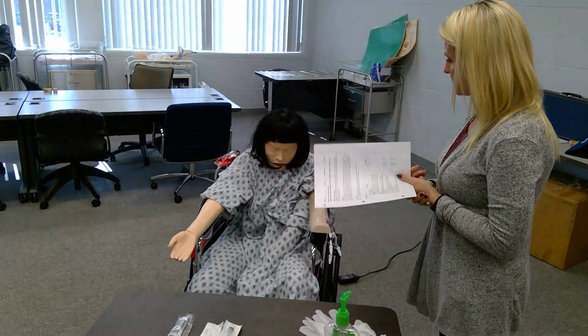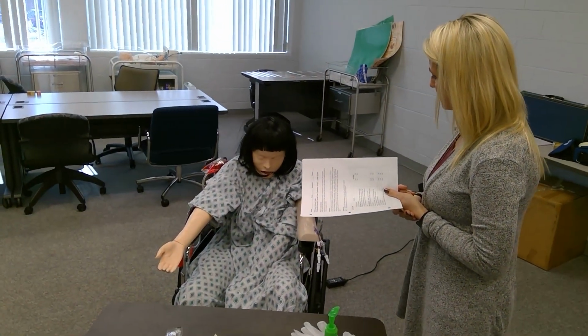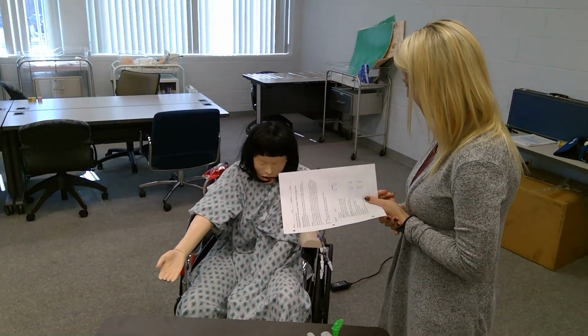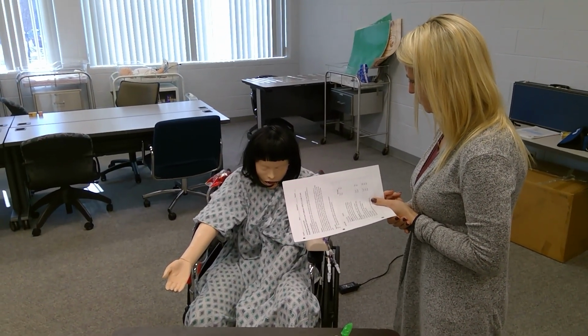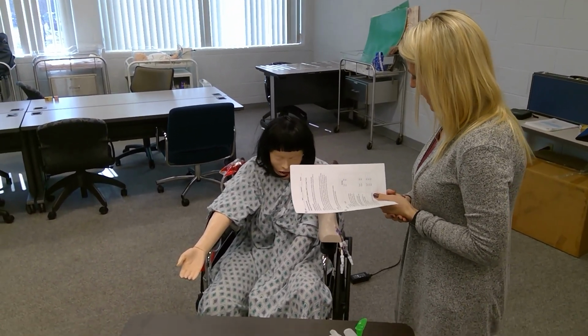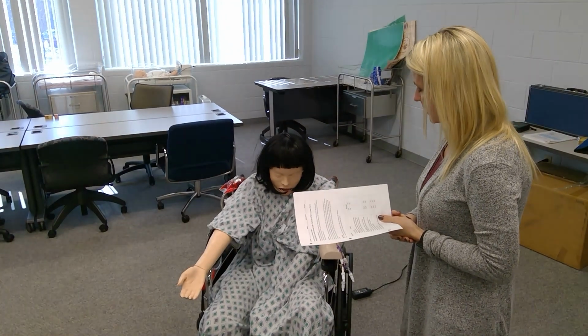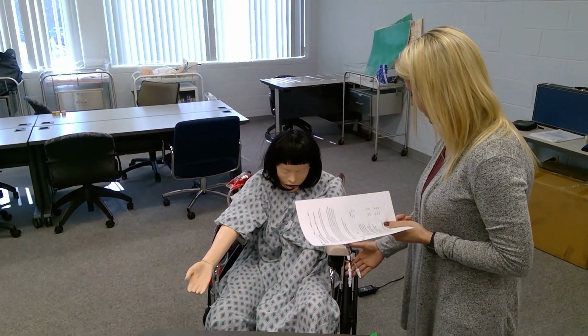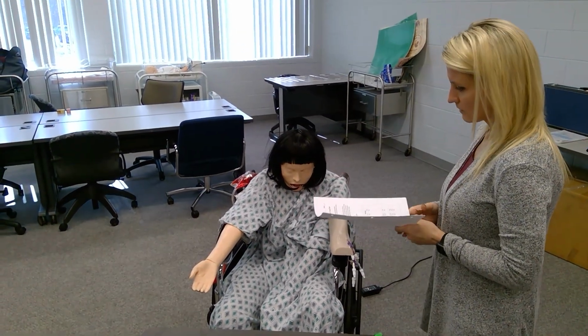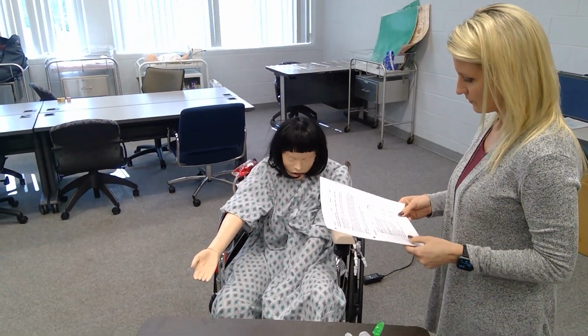Hi Sarah, my name's Brooke and I'm your nurse. Hi, how are you feeling today? Well, good. Hopefully we've got you on the road to recovery. I've got an order to draw a complete blood count, which is some blood through your PICC line here. Would that be okay with you? Oh yeah, that's fine. I did that yesterday too.